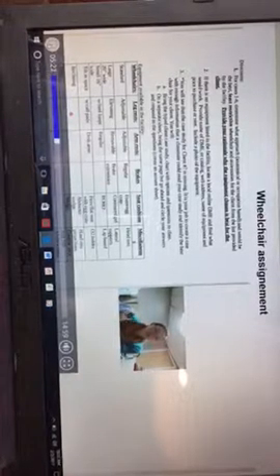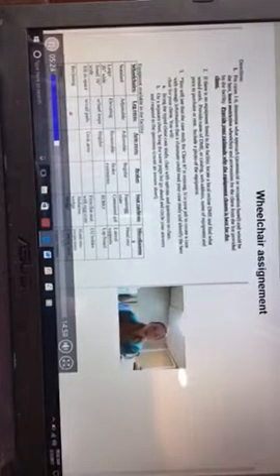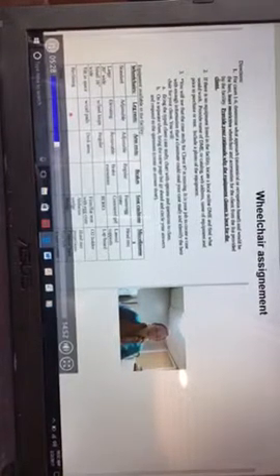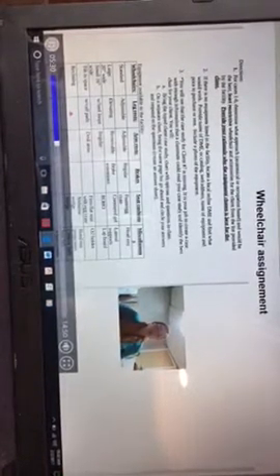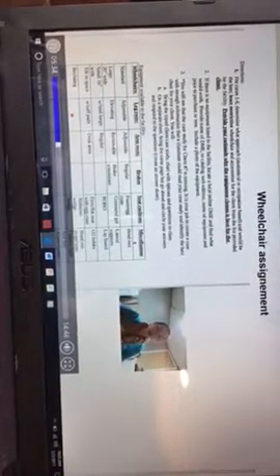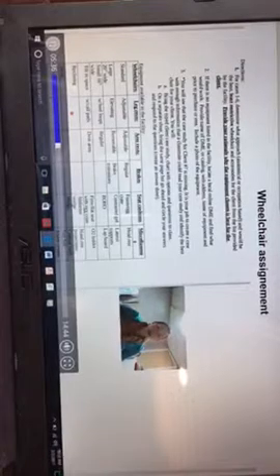The removable versus adjustable. Adjustable are always helpful because in order to get a good ergonomic fit, if you have somebody who's going to be living in their chair, you want to be able to adjust the arms to where they need them to be, or else you're going to run into different orthopedic issues.